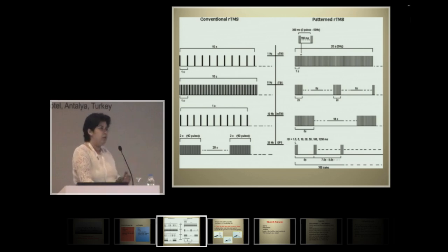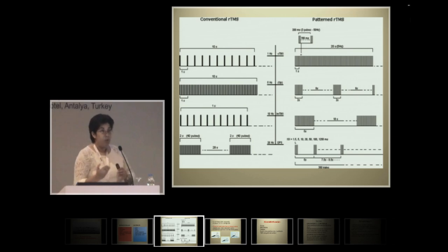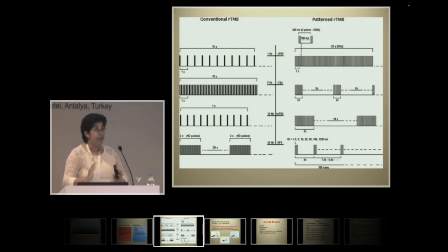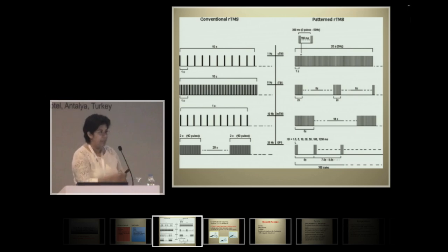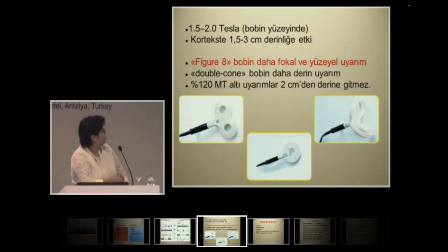So these are just details, and they concern safety. Most of the safety concerns are related with the technical settings of the device. They have been defined in the guidelines. So the guidelines tell you what Hertz is safe, or how long the time between the 2 pulse sets has to be for the delivery to be safe. So you have to follow the recommendations and the guidelines.